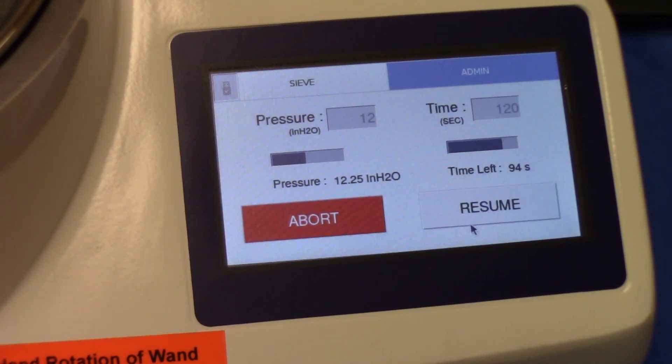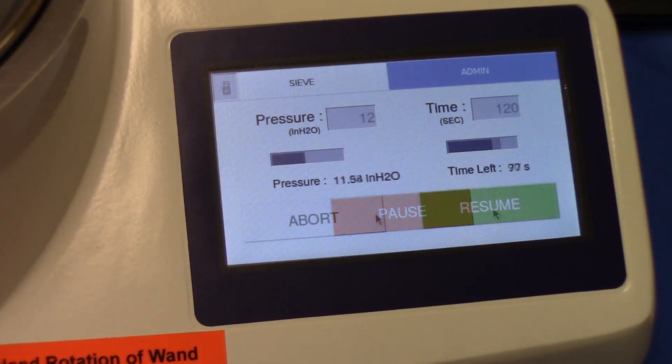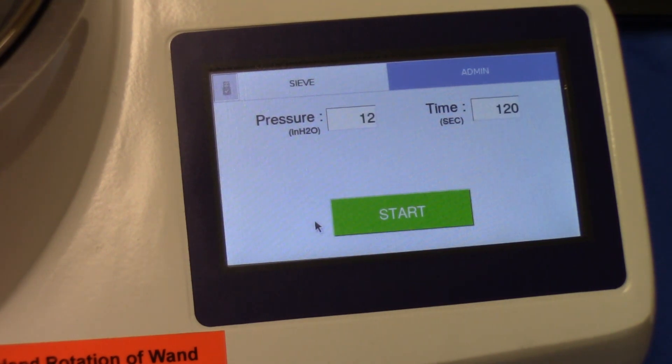You can then press resume or abort. The only time you would press abort is if there is really nothing left on the screen after a short period of time. Once the time reaches zero — or you abort because nothing remains on the screen — the vacuum pressure adjustment valve resets itself, finds home, and we're ready to start another test. The pressure and sieving time are retained, so they do not need to be re-entered each time.